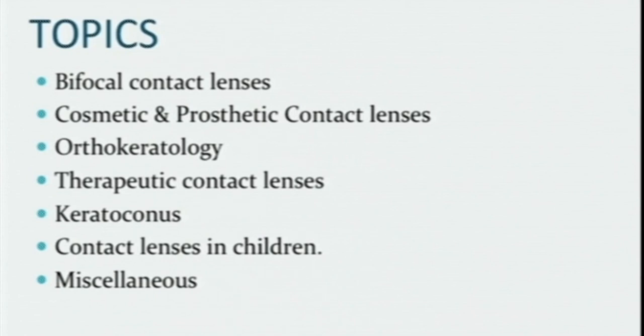Since there is a paucity of time, we can have the different other types of contact lenses available: bifocal contact lens, cosmetic and prosthetic lens, orthokeratology, therapeutic contact lenses, keratoconus contact lenses, contact lenses in children and miscellaneous. Orthokeratology is a different type of lens where you have reverse geometric curve lenses, which are used during night time, and the patient removes the lens in the morning.